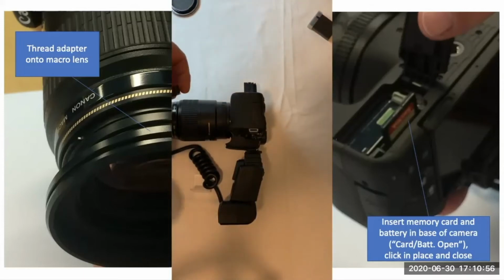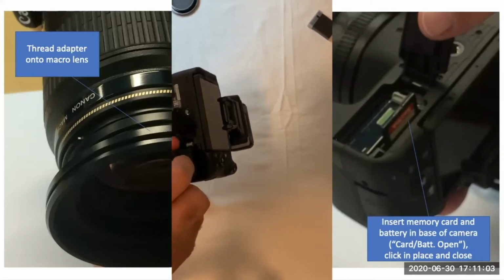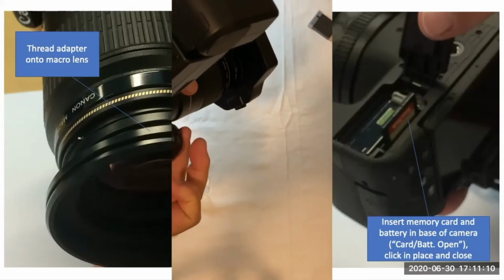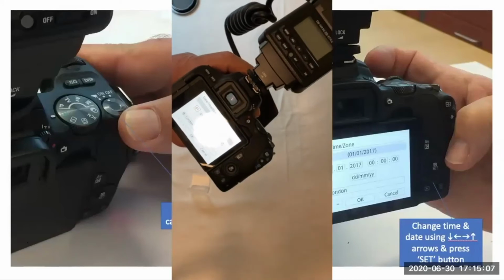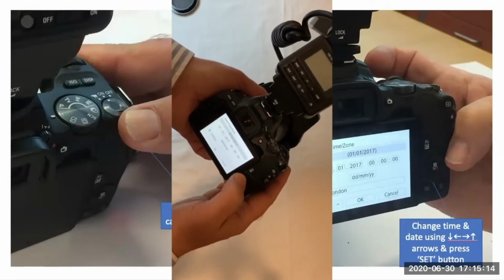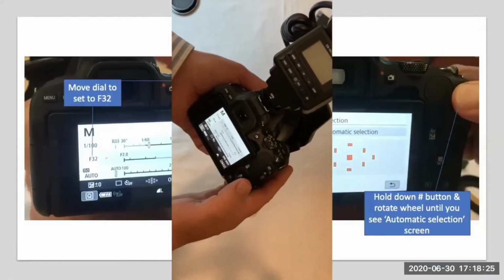Find a battery that's got a bit of power in it, and hopefully the camera will come to life. Place the battery in position, close the lid, and switch it on to the on position, and it's functioning. So go across and change the time and date by moving these arrows around left and right and changing the numbers associated with that. I won't do that now.